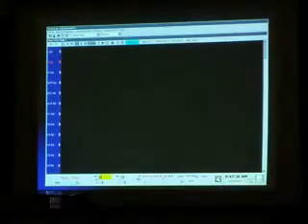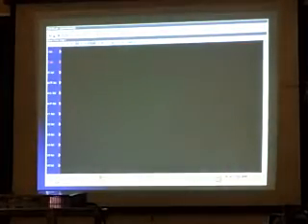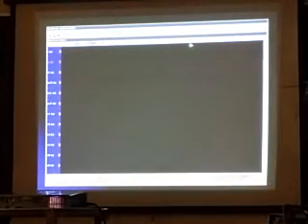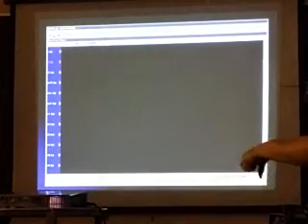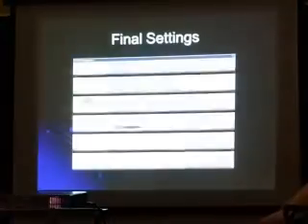And that's what you see up here. Ignore this blue one. These are the 4 pacing channels. And you see how they're gray right now? You know what that means? They're off. Not going to do anything. If they're red, you can pace through that channel. Why do we make it red instead of green? You remember how I told you that stimulator is dangerous? It's red. Warning, you can pace in the ventricle now. But only you. I'm not going to let anybody else pace in the ventricle. All right.